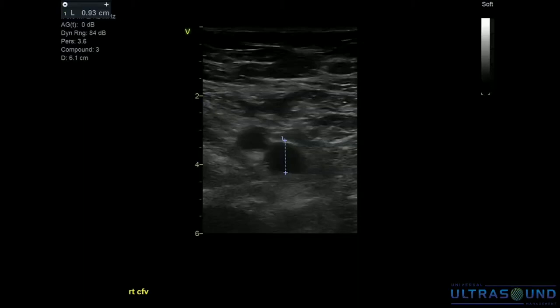In 2022, we did an assessment of her bilateral lower extremity veins because she came in with persistent swelling and pain, the same symptoms she had in 2020, but since then was doing okay. So her right side was normal. She had some chronic changes in the vein, but ultimately nothing new, because what we've learned in this space about venous disease is that clot begets clot, right? Somebody could have chronic DVT and then also get new DVT on top of that.